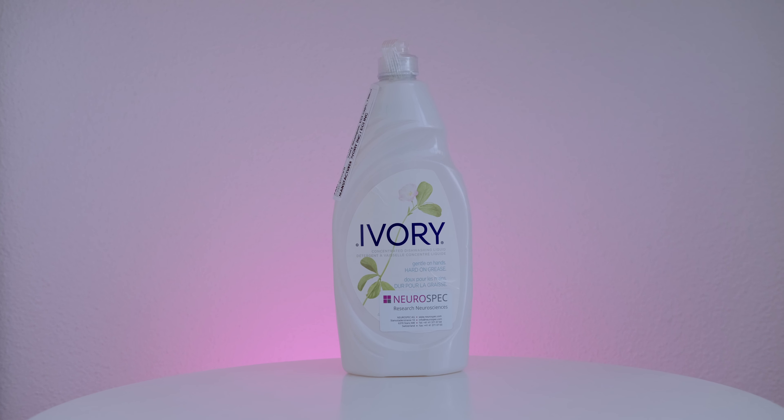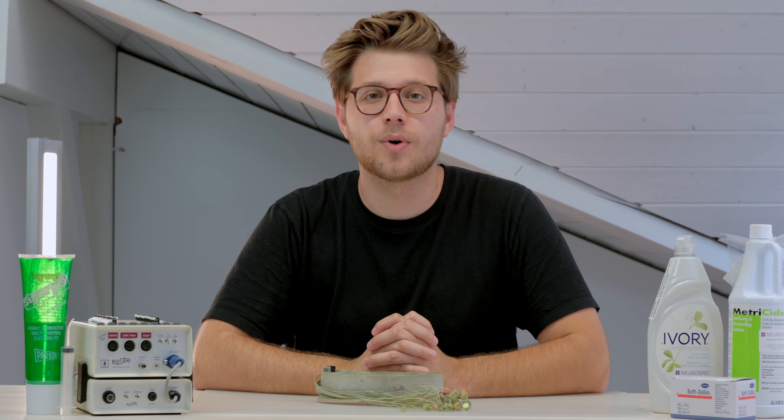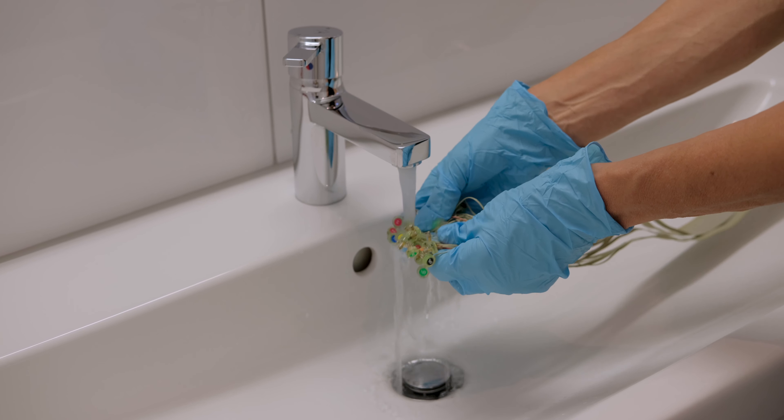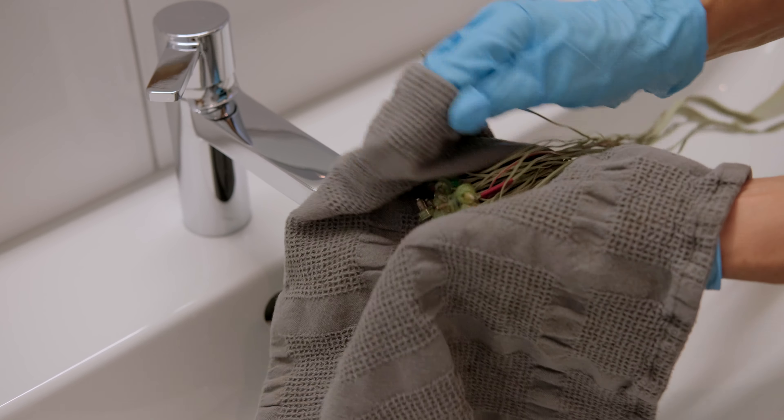You're going to need soap — we recommend Ivory soap or simply some cleaning-appropriate alcohol. Wearing rubber gloves is a must. Start by cleaning your electrodes with your soap of choice under hot water, then dry them with a clean dry cloth or paper towel and leave them in an alcohol bath for up to five minutes.